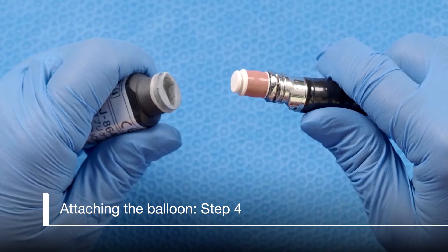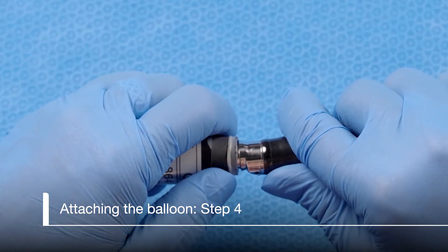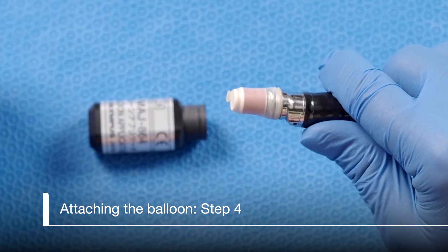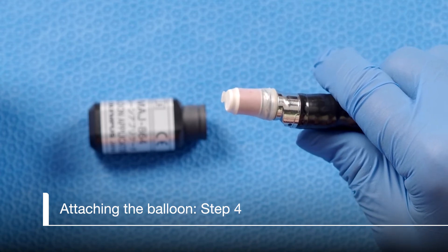Using the applicator, place the balloon over the scope up to the second groove. Using your finger or thumb, roll the ring off of the applicator into the groove, then remove the applicator. Take care not to rub the balloon between the applicator and the scope, as this can sometimes rub a hole in the balloon.